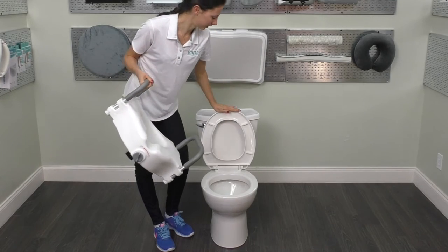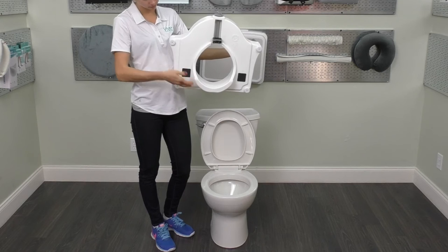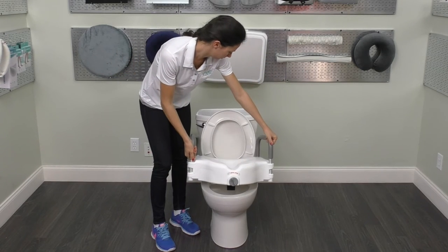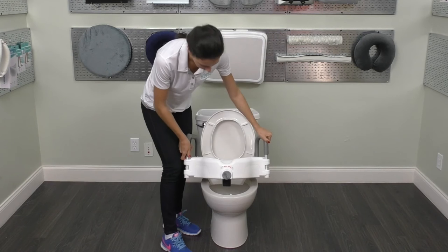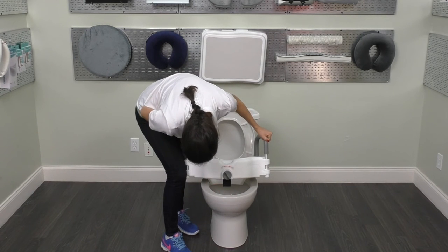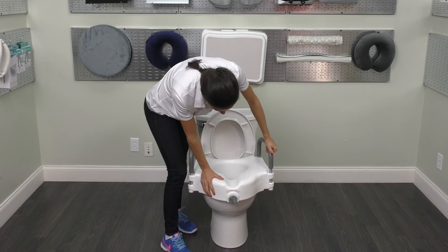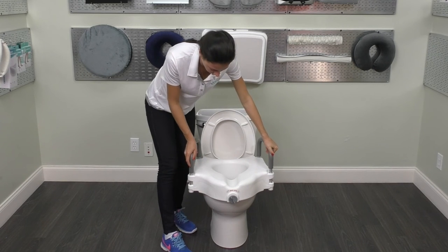Lift toilet seat lid and place rear wings of the toilet seat around the rim of the toilet bowl. Some toilet bowls may require that the seat assembly be removed to allow proper fit. In addition, the front adjustment bracket must clear the rim in order for the raised toilet seat to fit securely. Straighten and center the product over the toilet bowl as necessary.